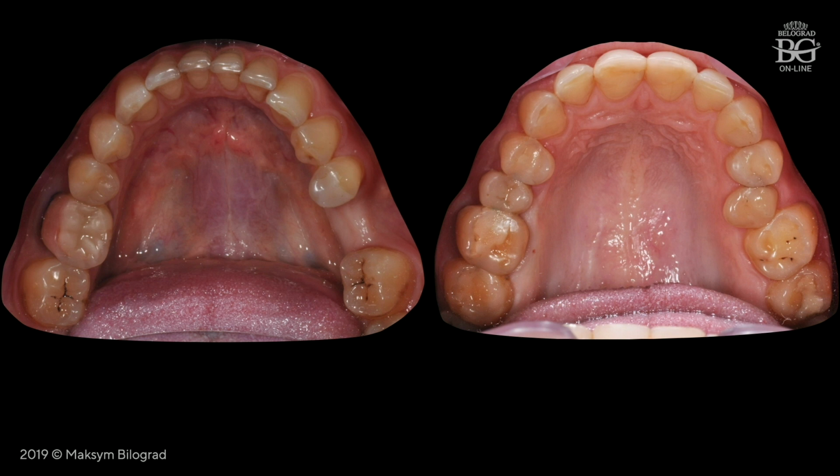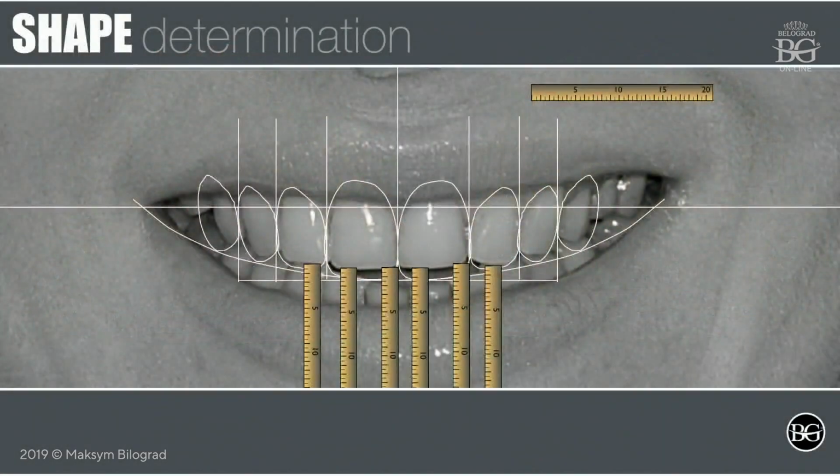We decided to use the so-called copy-paste technique as a more economical option, but the treatment planning of the copy-paste technique is absolutely based on the common principles of full mouth rehabilitation cases. In this case, I followed the principle called facially engineered treatment planning. So the aesthetic part of the treatment planning was taken as the base for occlusal rehabilitation. In other words, we used golden proportions and templates to understand the exact length for the central incisors from an aesthetic point of view.